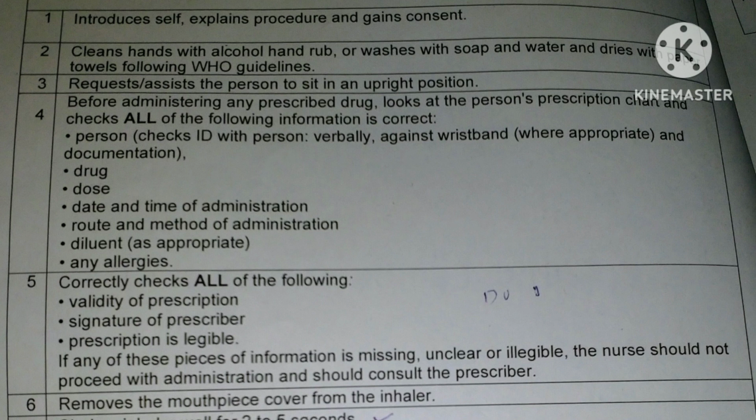Then before administering any prescribed drug, look at the person's prescription chart and check that all of the following information is correct. First, we have to check the identity of the person. We should ask them, could you please tell me your complete name and date of birth? Then we should cross-check it with their wristband. If there is any allergy, we should check that also, and ask especially what reaction they experience whenever they take this medication.